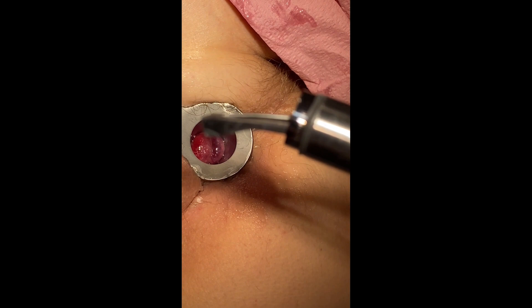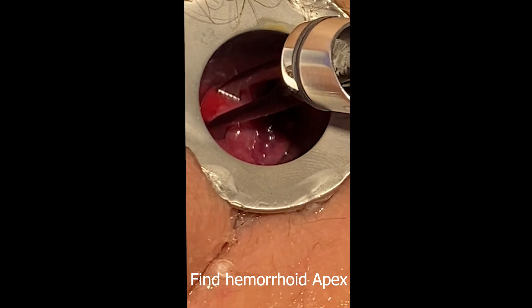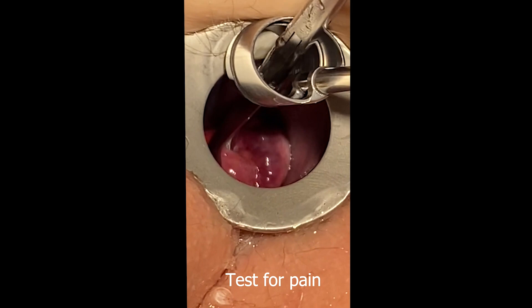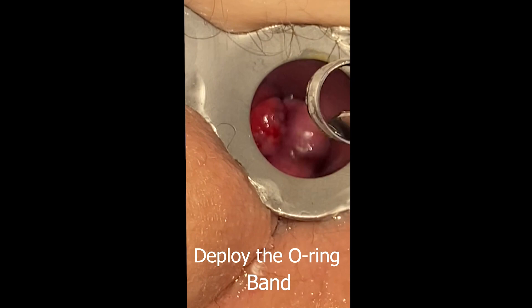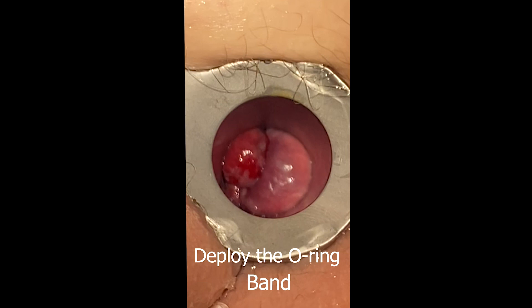Pass the grasping forceps through the ligating drum. Find the apex of the hemorrhoid and grasp the area to test for pain. Insert the drum while pulling the hemorrhoid tissue into the drum.